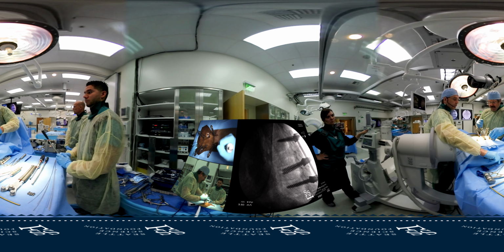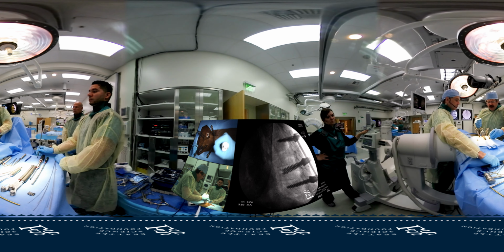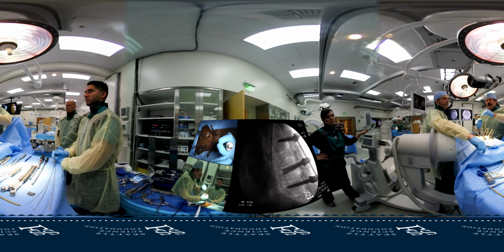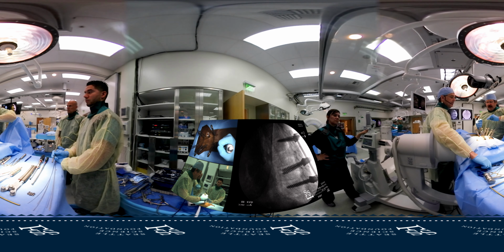And so I'll drop my rod in all the way. The other thing I would tell you is you want to make sure your rod, as you put it in, is deep to the fascia. If it's not deep to the fascia, as you put your screw in, the fascia will pucker. It'll pull the fascia down into the wound, and it makes it much more difficult. So when you initially put it in, you want to be deep to the fascia.